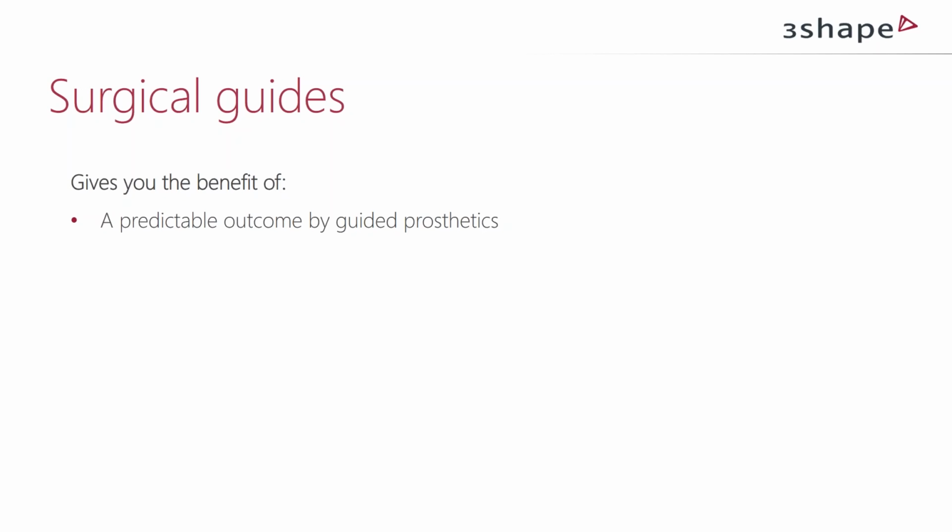Yes, and I think that's a very important point. I mean, guide to design and to use a surgical guide is part of the well-known guided surgery principle established in the industry or by dentists for many, many years. And this is what we're going to focus on today. But there's more to it because the guide is just the first step to allow guided prosthetics to finally treat the patient with a predictable outcome as planned at the very beginning and also as communicated with the patient.